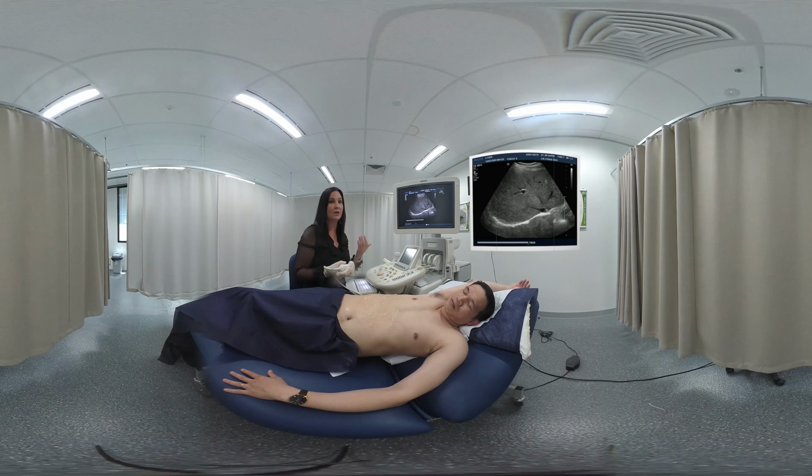Now, other disease processes that you may have to look for are hepatic cell carcinoma, HCC, and also when a person actually has a disease process such as cancer, you may have to extend the study and look for things such as ascites. So ascites is extra fluid. You can get exudative and transudative, and we may be looking for these in the abdominal cavity. Another disease process that we may investigate also is thrombosis. So in a diseased state, the body has a higher coagulation factor, so it may be our job to look at the IVC and the hepatic veins and ensure that we rule out thrombus.